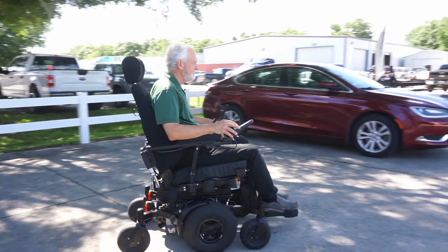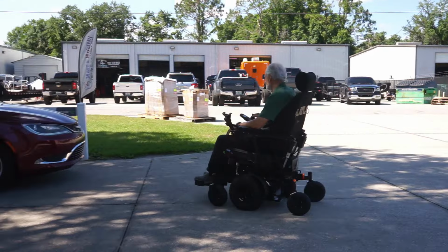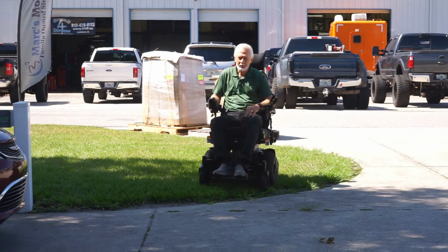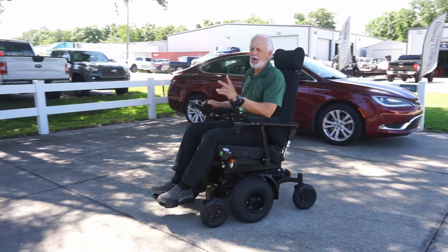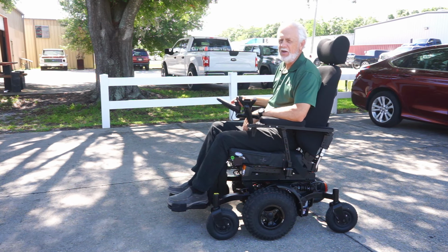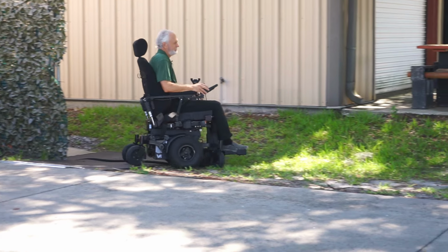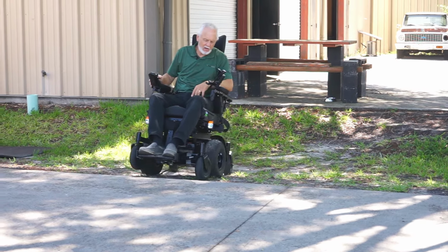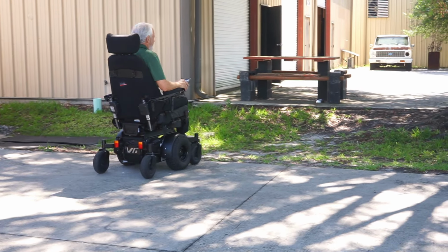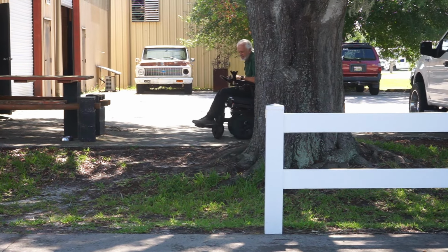We're going to go in the grass here real quick. This is not even, you guys stay right there, watch me right here, I'll go right here. There's a big incline, it's all rough terrain, tree limbs and everything. You can watch me right from there. So right here is a 2-3 inch straight incline. You see how I jumped that? Right here is a bunch of tree limbs, and it's about 2 or 3 feet up in the hill. You see that?